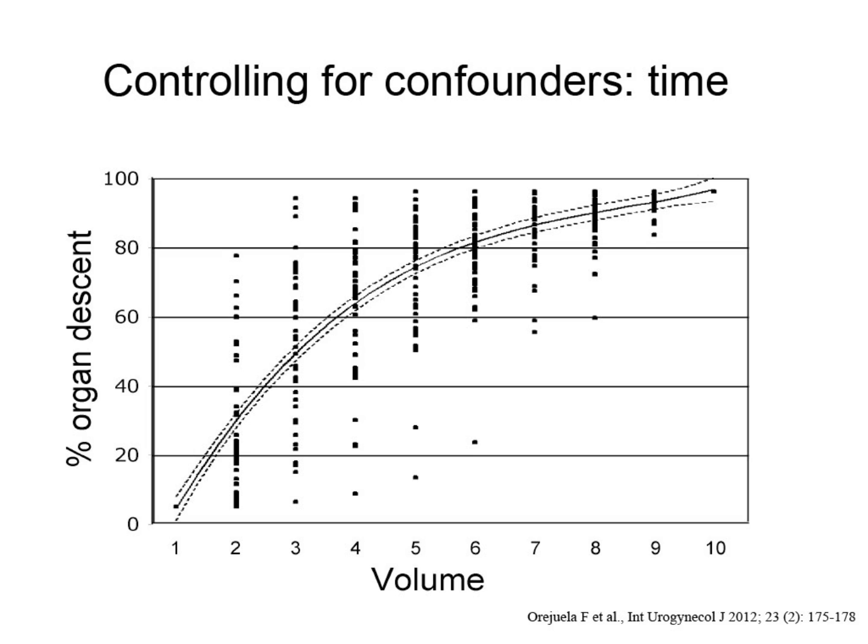descent. That's very important for clinical examination as well, because lots of people do Valsalvas that are much shorter than 5 or 6 seconds. Everybody who comes to my unit is surprised at how aggressive we are in getting people to push properly. Well, there's a reason for that. And imaging has informed that, because on imaging you continue to see tissues descend. So we don't stop the push after 2 or 3 seconds because the tissues are still descending. So of course we want to keep that lady pushing until those tissues have reached pretty much their final stage.